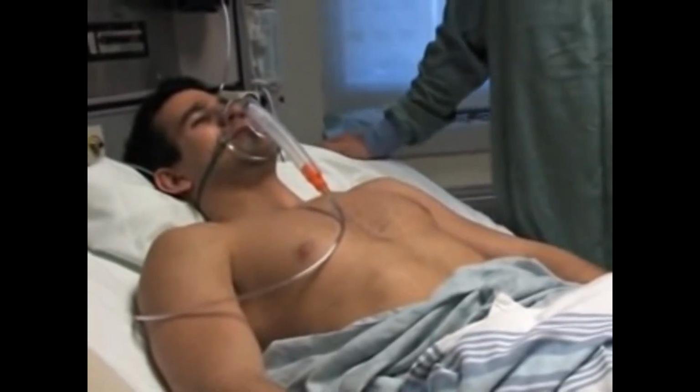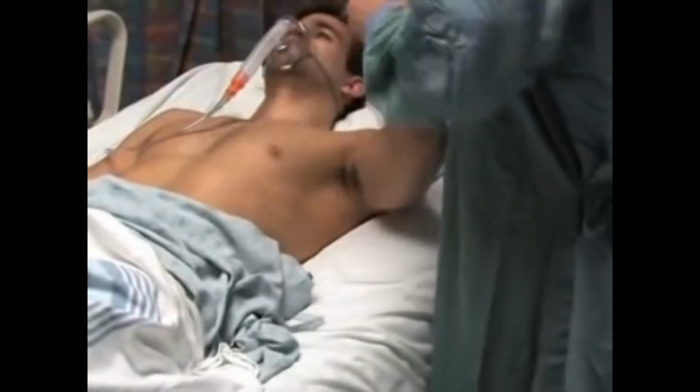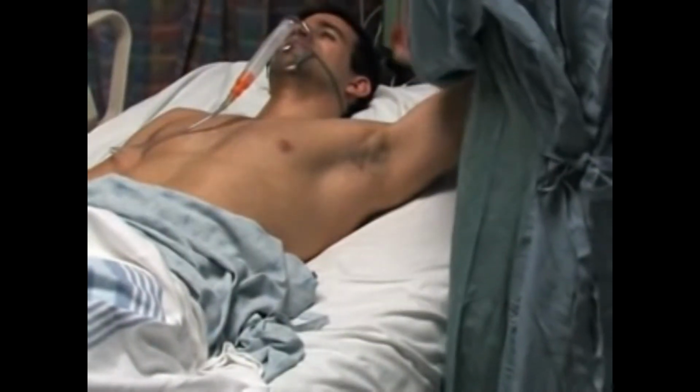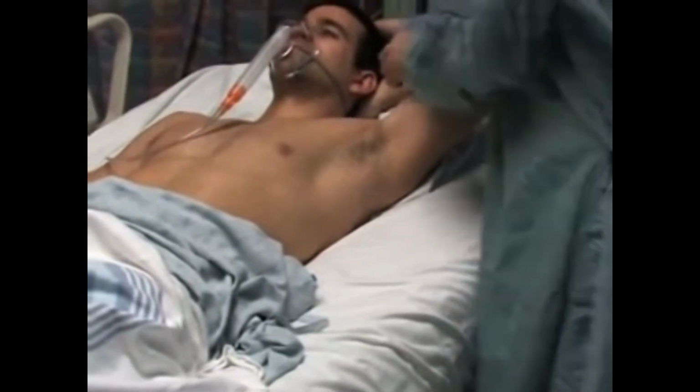The patient then should be positioned either in supine or semi-recumbent position. The ipsilateral arm may be maximally abducted to the side of the patient or positioned behind the head to have an optimal exposure of the insertion site.